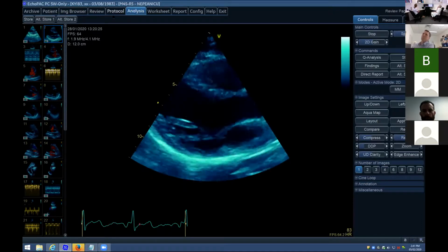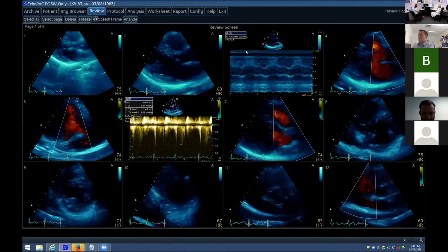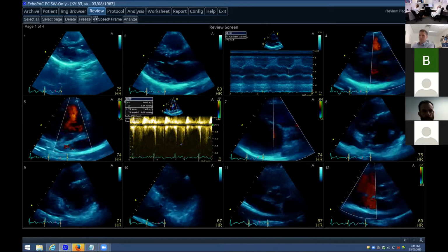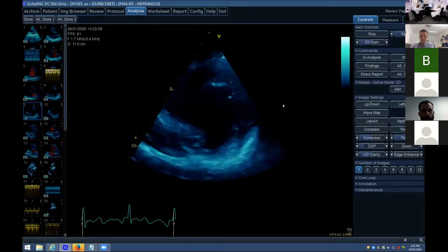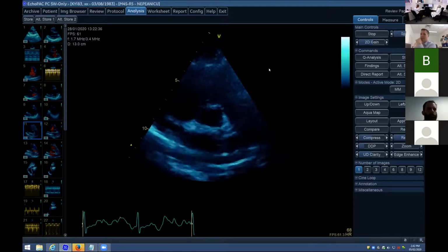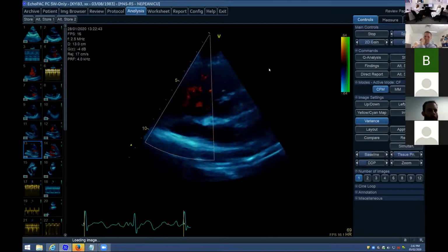Yeah. Very nice. And what I want to talk about is that if you can see all of these pictures, can you see that the parasternal long axis views look okay? Yeah. The short axis views are getting a little trickier. Yeah. And then the apical views in this patient, if I carry on trying to go down, it just sort of gets harder and harder and harder to image this patient.